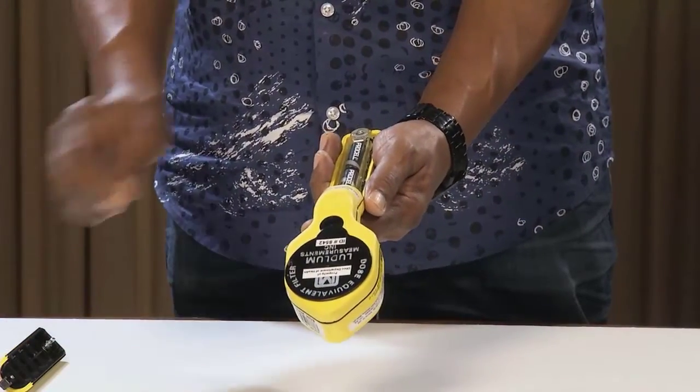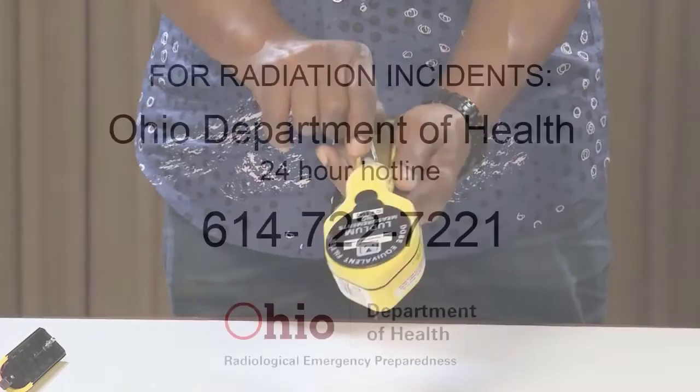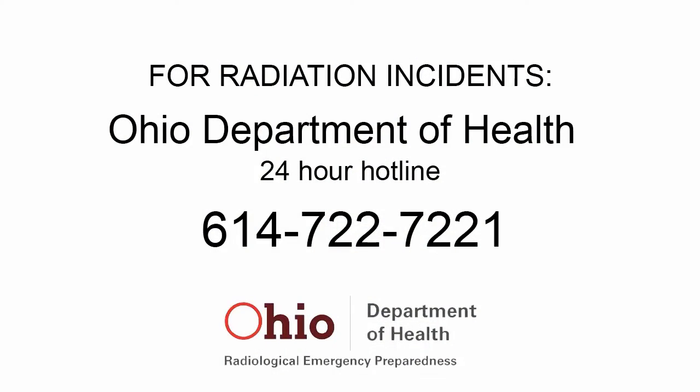After you have finished using the detector, remove the batteries to prevent corrosion of internal electronic components. For radiation incidents, notify the Ohio Department of Health 24-hour hotline at 614-722-7221.